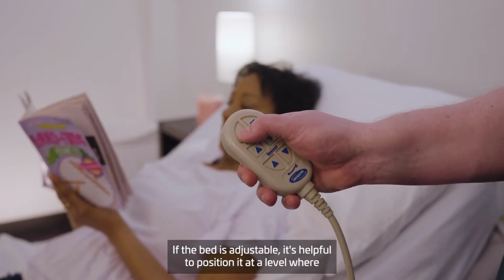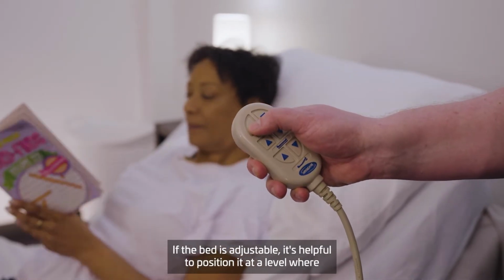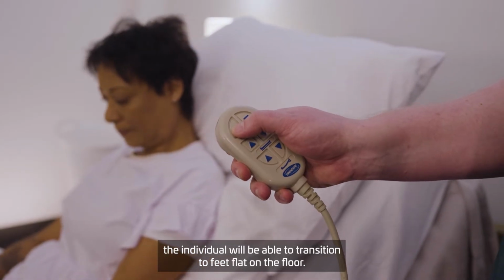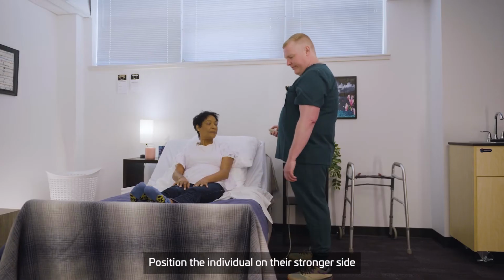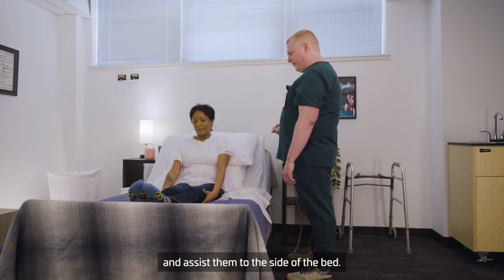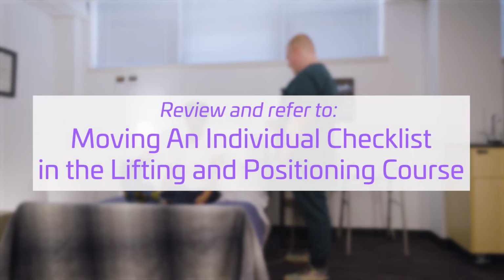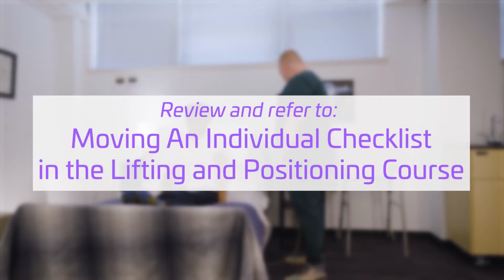If the bed is adjustable, it's helpful to position it at a level where the individual will be able to transition to feet flat on the floor. Position the individual on their stronger side and assist them to the side of the bed. To review how to do this, refer to the Moving an Individual checklist in the Lifting and Positioning course.